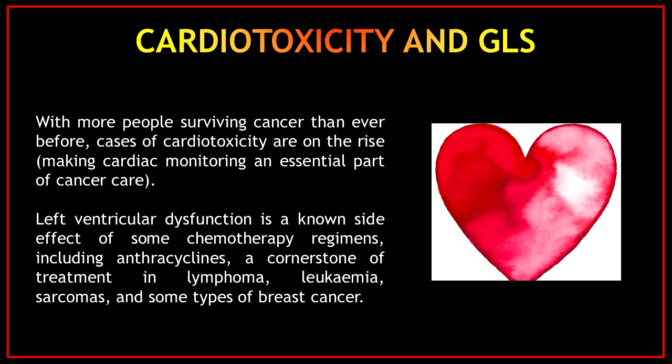Now let's talk about some of the uses of global longitudinal strain. The first one is cardiotoxicity. With more people surviving cancer than ever before, cases of cardiotoxicity are on the rise, making cardiac monitoring an essential part of cancer care.